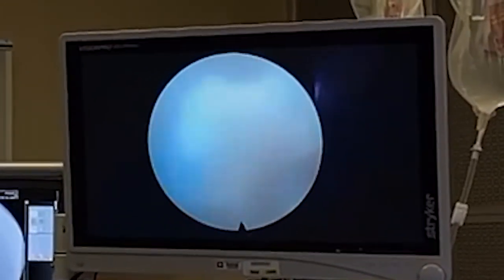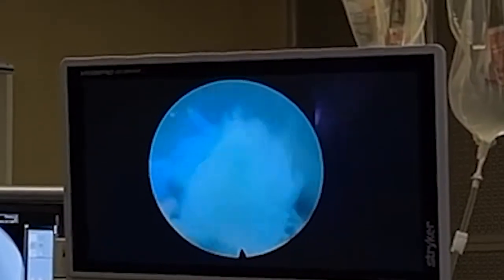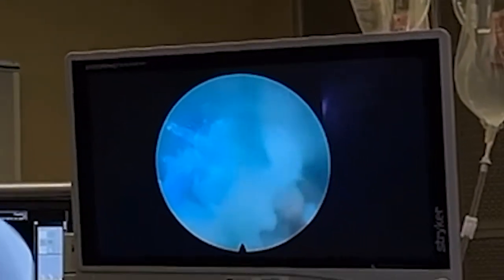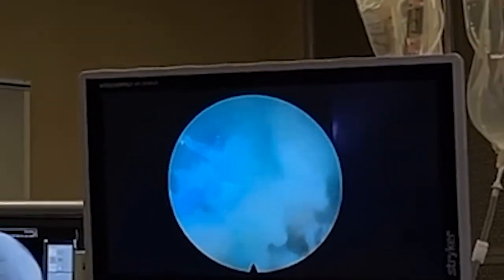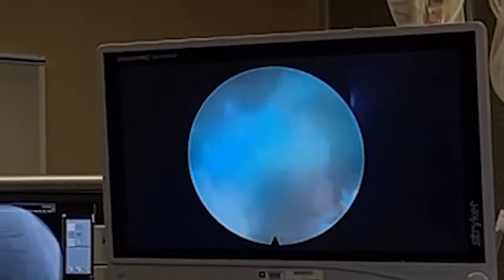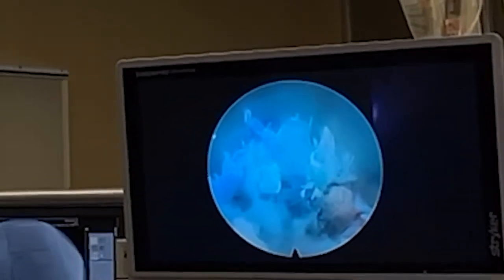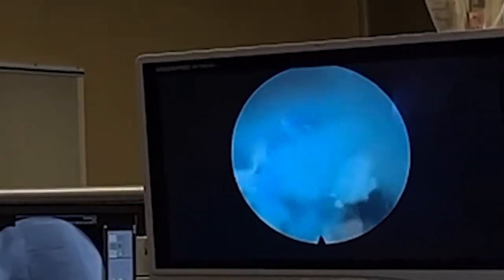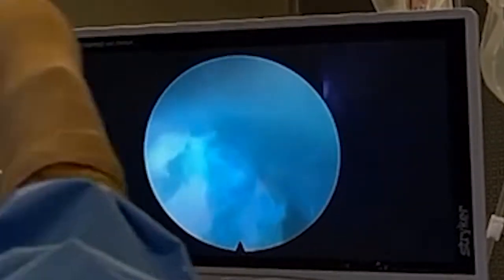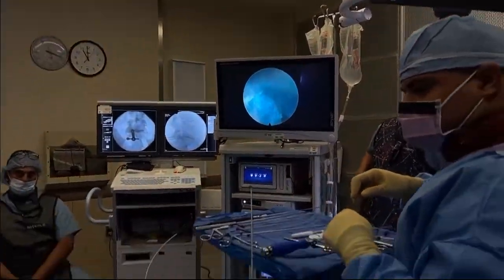Now I'm going to just sweep it away from me. Like a pimple popper on a big disc herniation. When I do that, literally the disc herniation comes flying out like a pimple popping device. It's oddly gratifying, in a sick kind of way. Oh, look at this. It's like a little mouse in my drain.